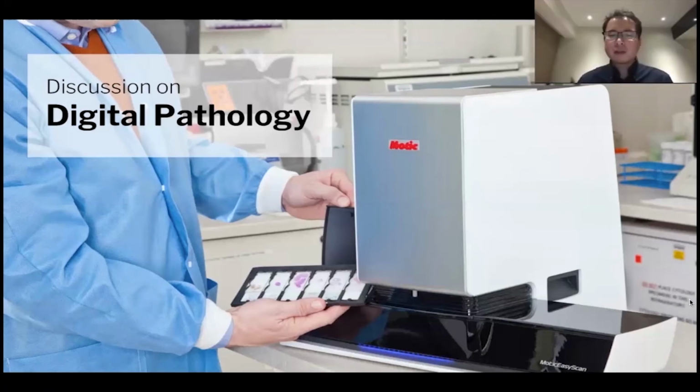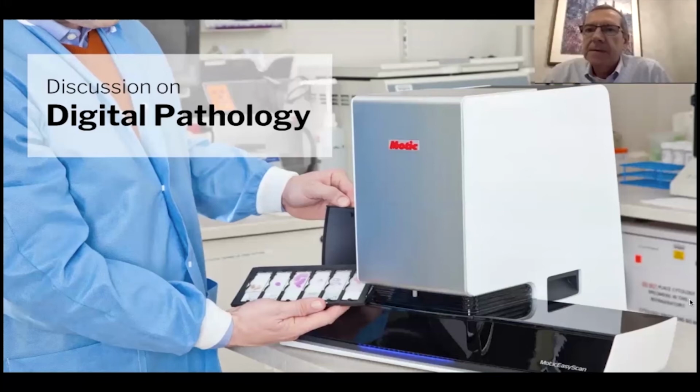Was the validation process very complicated at your institution, or how did you validate? No, it wasn't difficult. The way to validate the system, and there is some literature regarding that, the way we did it is that we selected a few cases, either immediate evaluations or frozen sections, and we had a pathologist blindly reading them with the system. And then we compared the results. Once they were satisfactory, we basically considered the system validated. I see.